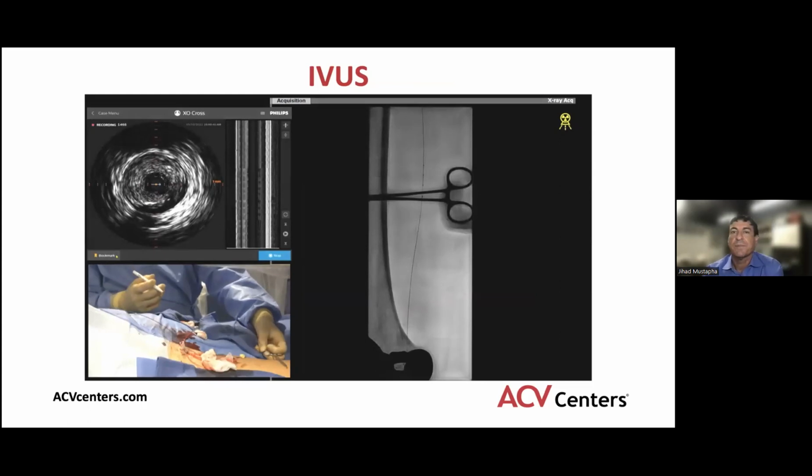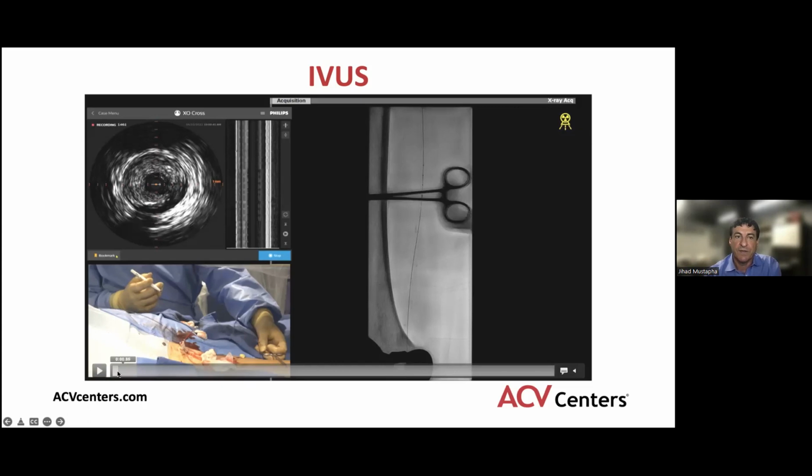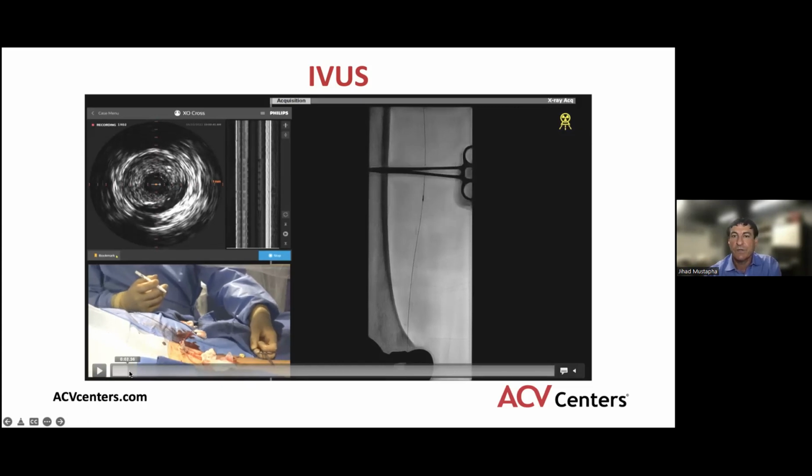This next step here is extremely important. Now, the angiogram did show high-grade stenosis. And now the question is, when you see something like this, what do you do with it? This IVUS image is a little bit intimidating when you first look at it, and it makes you think about what would be the best way to treat this.